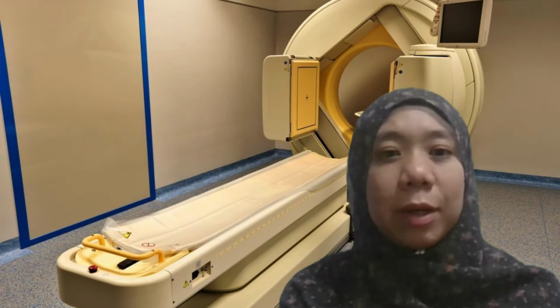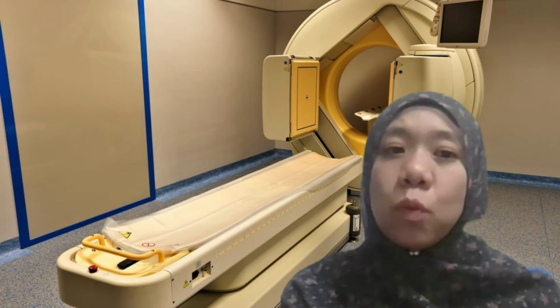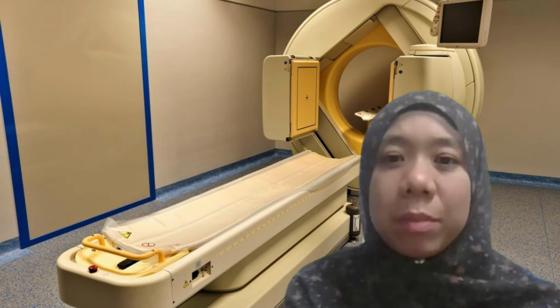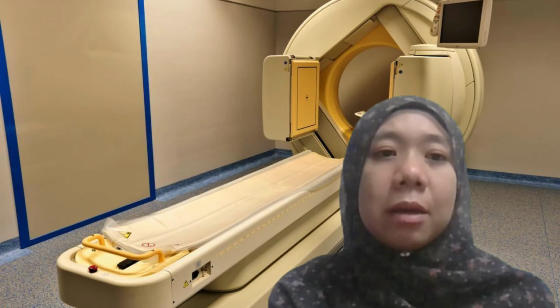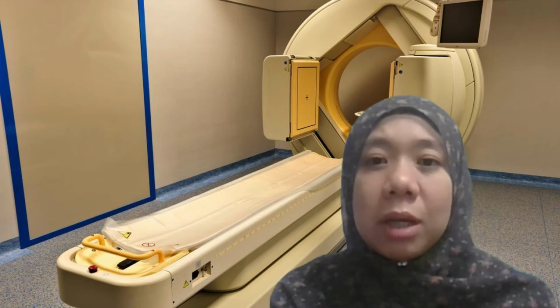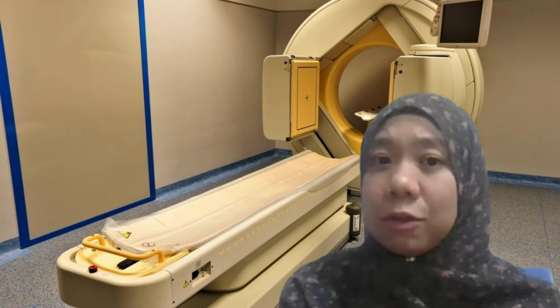So, I will explain to you what is nuclear medicine imaging. Nuclear medicine imaging is one type of medical specialty involving the application of radioactive substances in the diagnosis and treatment of diseases. So, in a sense, nuclear medicine is also one type of radiology because it records the radiation emitting from within the body rather than the radiation that is generated by an external source like X-ray.